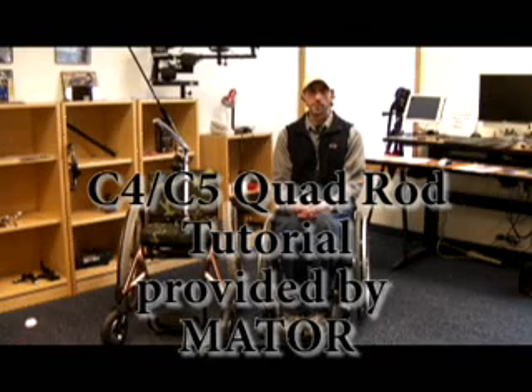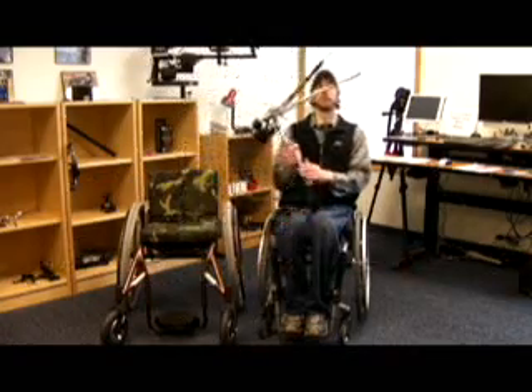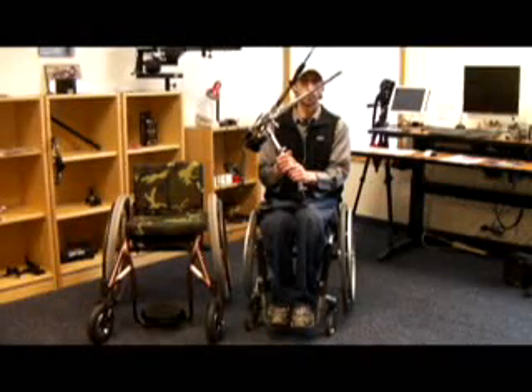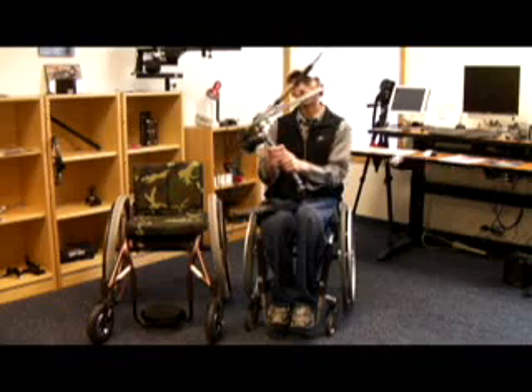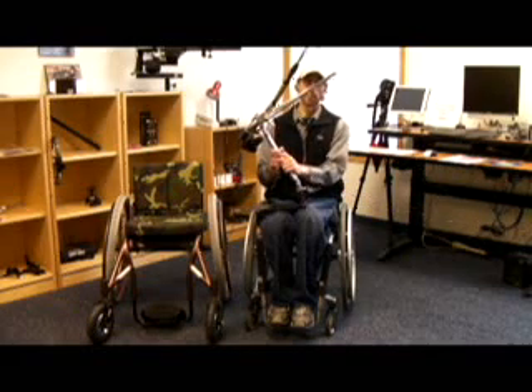Welcome to the tutorial for the C4-C5 quad rod. This rod is designed for users who have limited tricep movement or arm strength. I will show you how to properly install, adjust, and troubleshoot this rod.